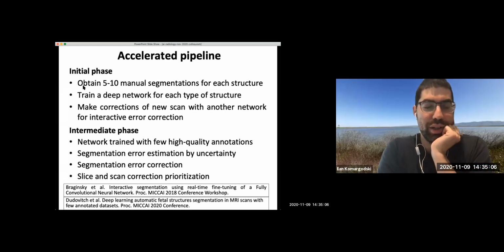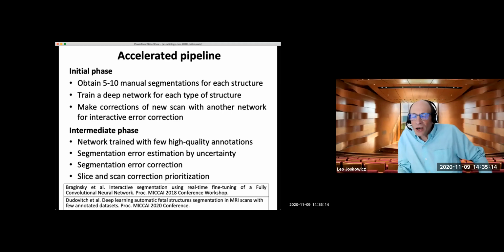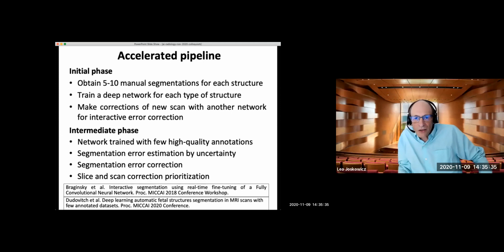I have a quick question. Yeah, sure. Why can't you use existing examples? Is it just a matter of regulation? No, there are many CTs and MRIs, but nobody has delineated. For training a network, you have to give examples to train. Okay, so basically you don't have the delineations. So access to examples is not an issue, it's just about annotating them. It is an issue, but it's not the main issue. There are some public data sets available, but very few of them, if any, have the annotations.